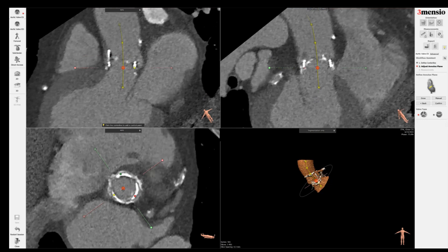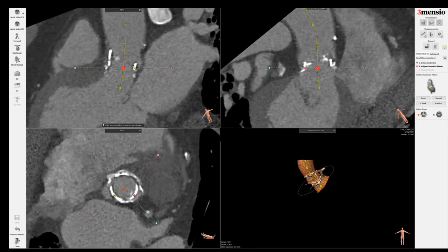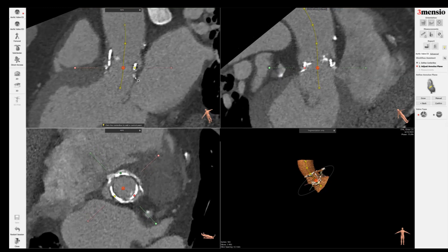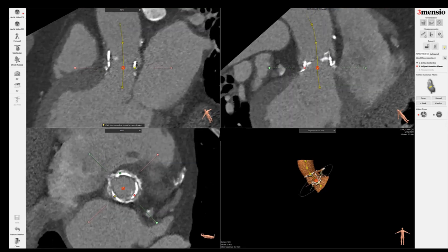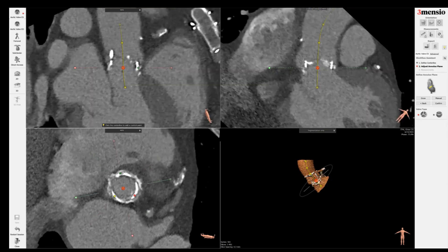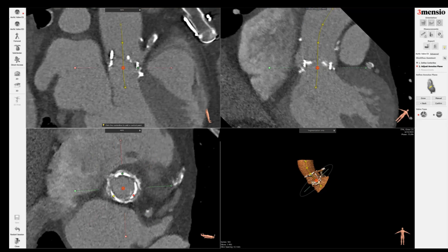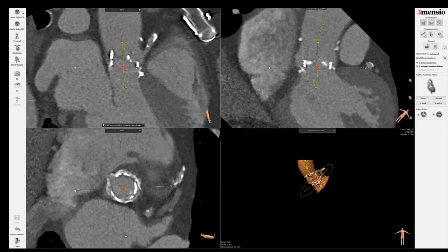Now you can see I'm at the base of the surgical valve. I have to fine-tune the assessment so I want to be at the center of the rim and at the base of the rim, so that you can get the proper height. That looks pretty good on yellow dots. I'm going to go to the green dot now, center it, and go down to the base.